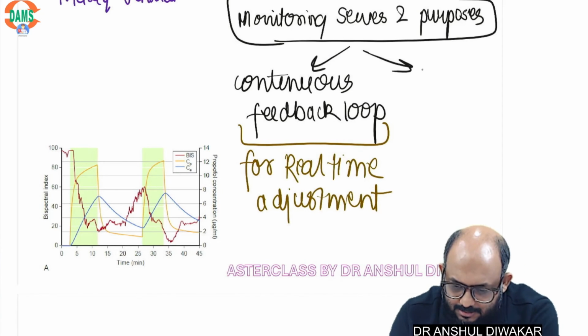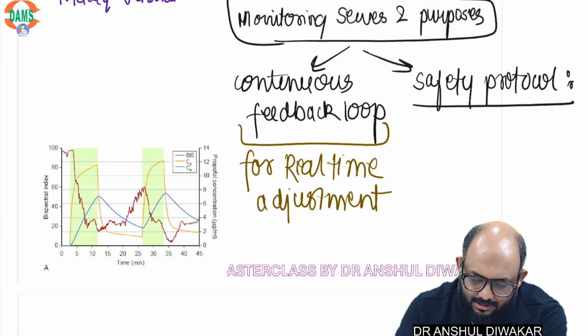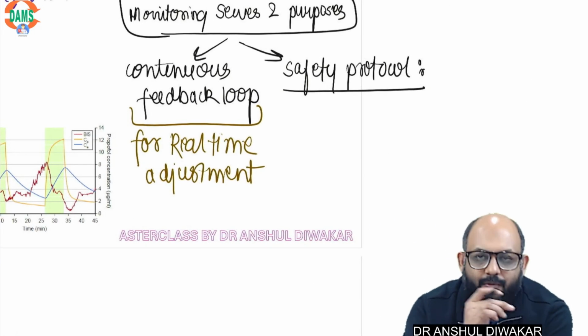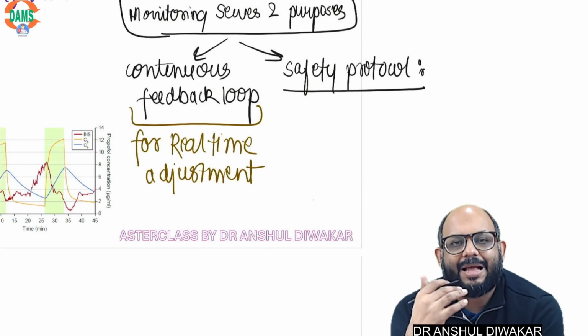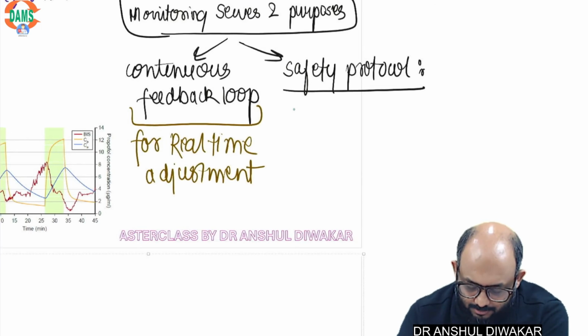Secondly, it acts as a safety protocol. You are giving these drugs in an infusion. You need to be aware of their safety. So they will act as necessary alarms and backup systems can be activated.